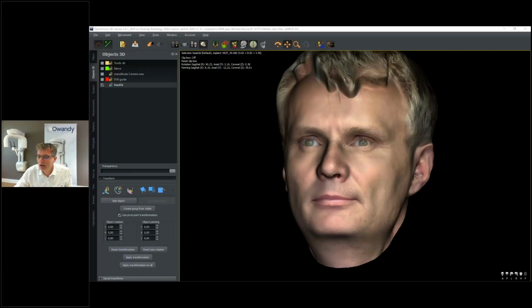Sometimes the patient does not understand why the cost to put in place an implant is a high cost. And this is a way for you to show, within very few minutes, how to give a value to your work as a dentist.